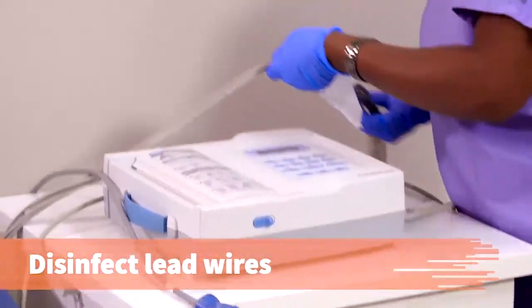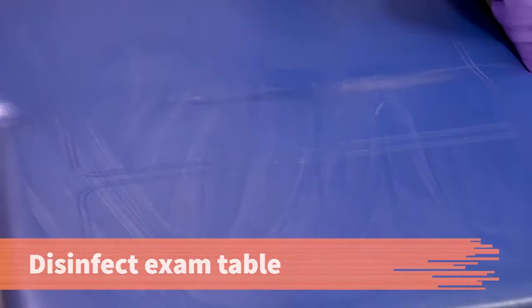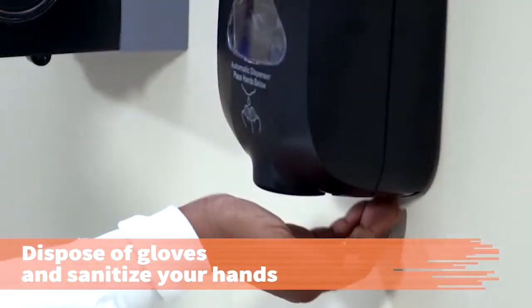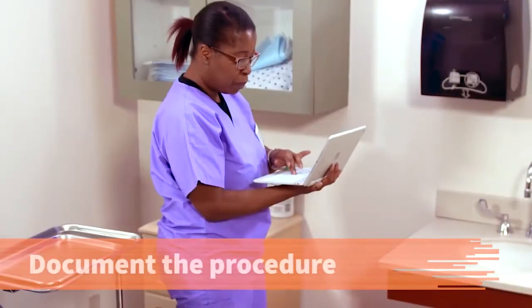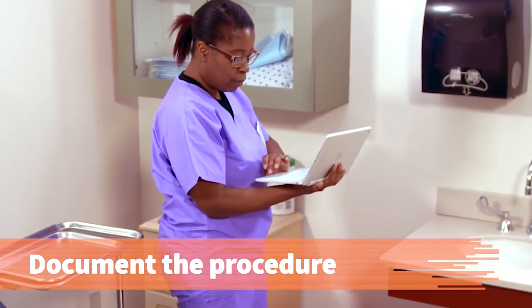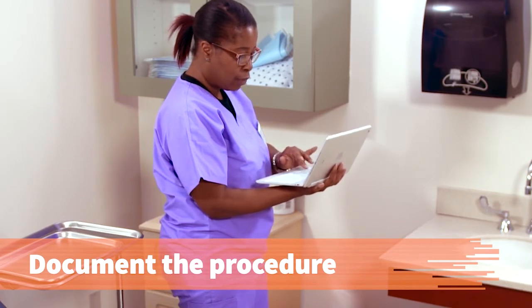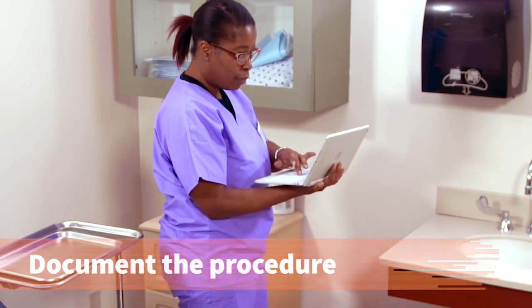Disinfect the lead wires per the operator's manual. Disinfect the exam table. Clean up the work area. Remove your gloves and dispose of them. Then sanitize your hands. Document the procedure accurately in the patient's record. When documenting, indicate the provider ordering the test, what test was performed, how the patient tolerated the test, and what you did with the ECG tracing. You can also add any instructions you provided to the patient regarding follow-up.